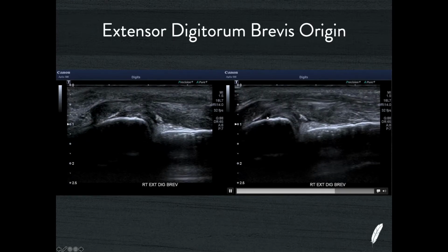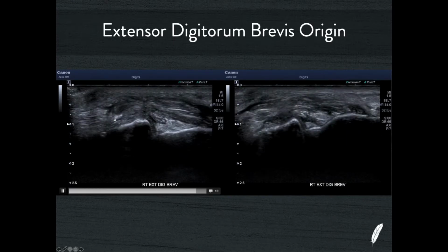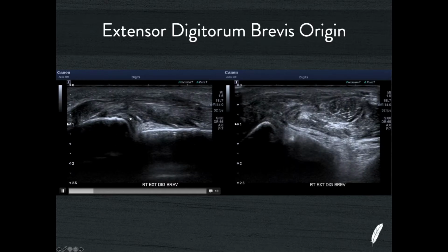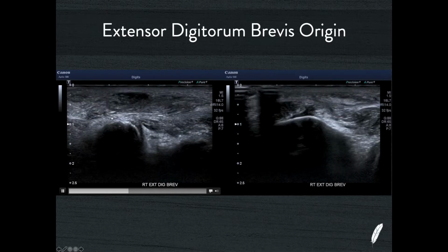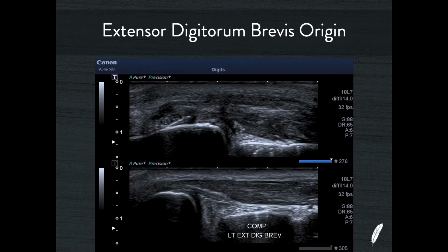And you can see here how disrupted this muscle is, and you can see all this periosteal lifting here, this echogenic periosteal stripping, where extensor digitorum brevis has been stripped away. The calcaneo-cuboid ligament is normal, and the anterior tubercle of the calcaneum is preserved here, and this is a muscle origin injury rather than a CC ligament injury.